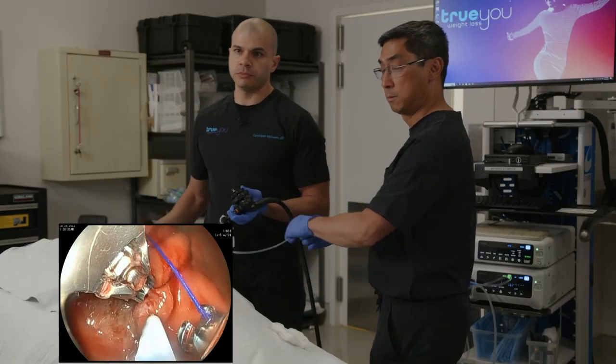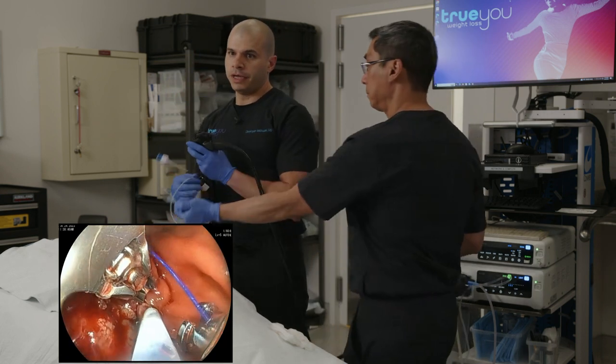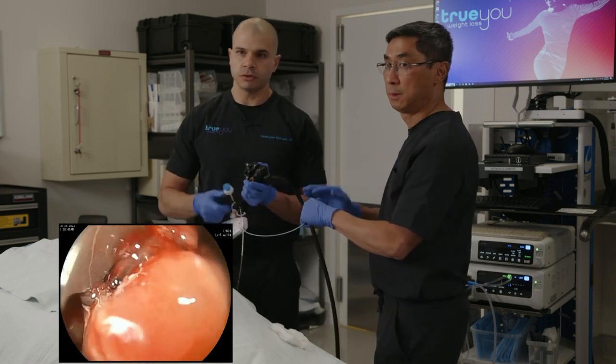Here. So I'm doing a running suture, by the way, so I'm going from anterior wall of the pouch to posterior wall and then back around, and that will reduce the size of the pouch. I'll take another question.